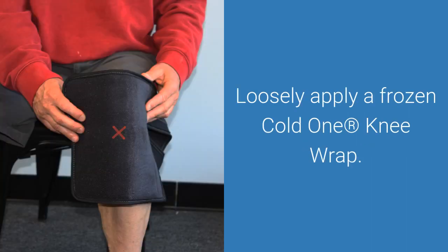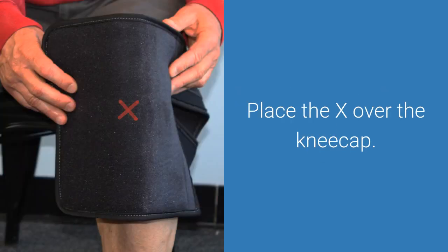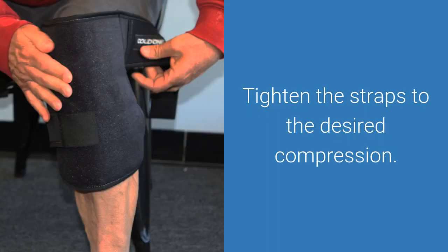Locate the X on the Cold One Ice Wrap and place that X directly over your kneecap. Affix the Velcro straps loosely to position the wrap directly over the knee, keeping the X over the kneecap. Once the wrap is in place, tighten each strap to the desired compression, making sure there are no air gaps anywhere around the wrap.